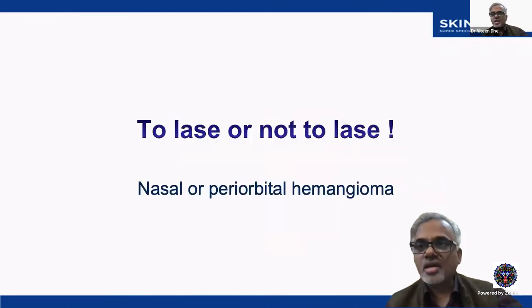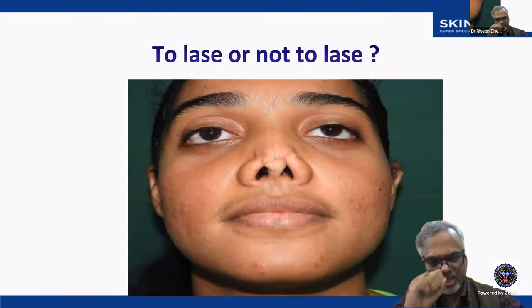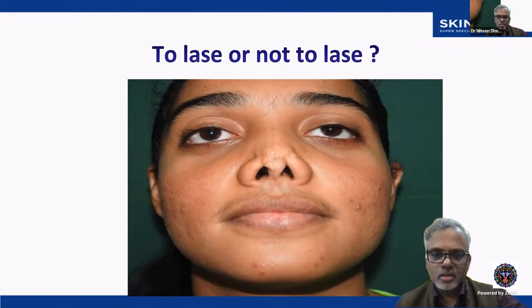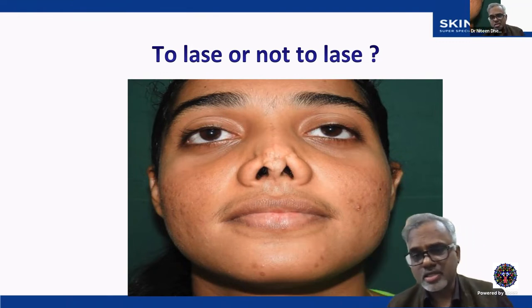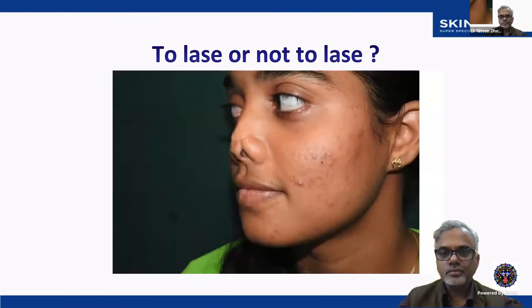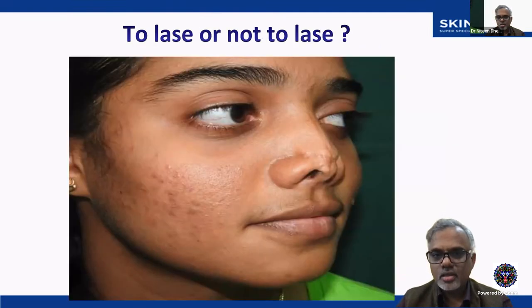Okay, next, the dilemma is to laser or not to laser if it is periorbital or perinasal. This was a case 30 years ago. The best plastic surgeon treated the nasal tip hemangioma with excision. Now this patient came after 30 years. At that time, the best plastic surgeon in the town, because no laser was available 30 years ago. So this was the outcome with the best possible plastic surgery.